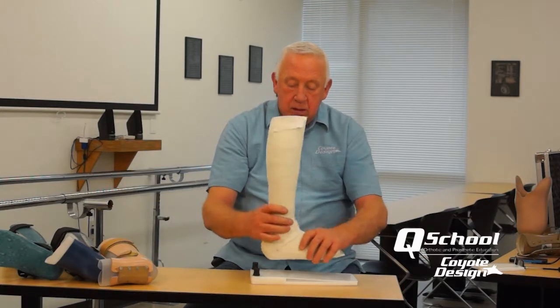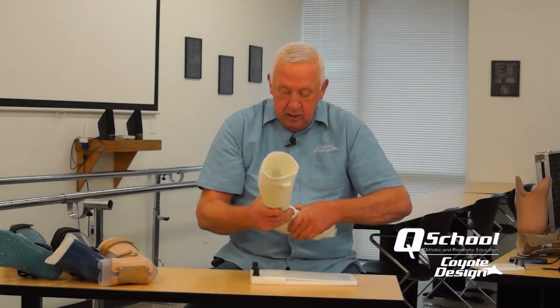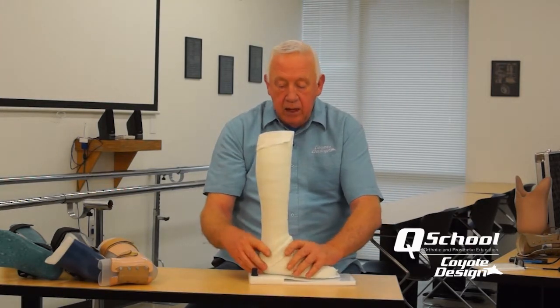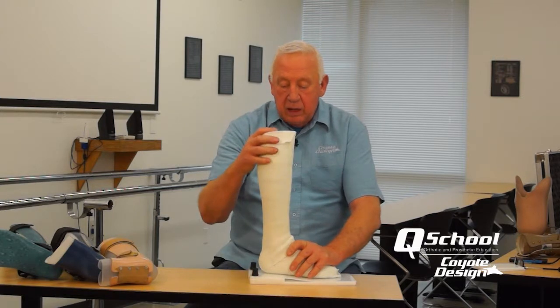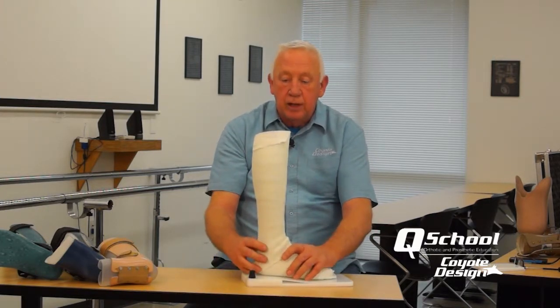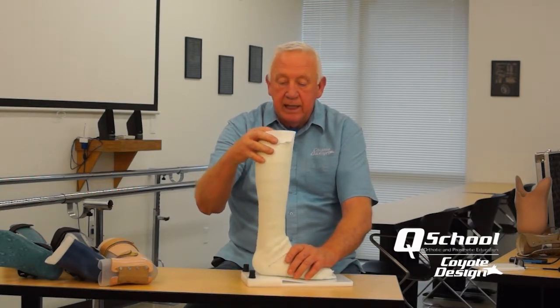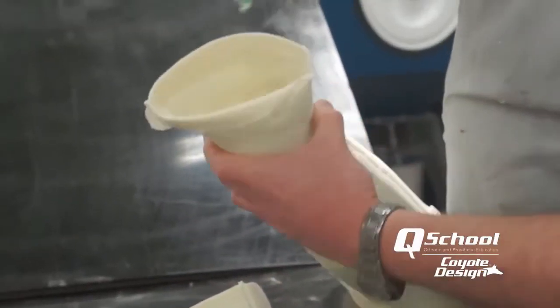The overlapping mold is done — it overlaps that inner cast. The practitioner, when finished casting, can take a look at this and decide if they want to do a bench alignment and change the alignment slightly. Then we just glue these two components together and it's ready to go to fabrication.